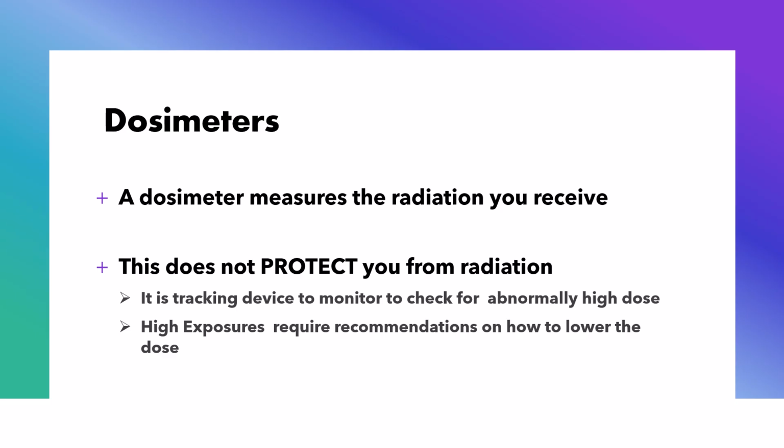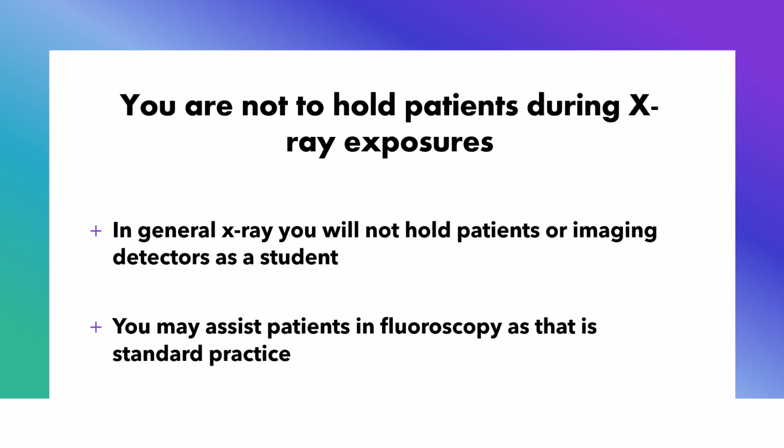A dosimeter measures the radiation you receive. Again, I've said this does not protect you from radiation. It is merely a tracking device to show how much radiation you have received. You're not to hold patients during X-ray exposures. In general X-ray, you will not hold patients or imaging detectors as a student. As a real technologist, you will have to do that.